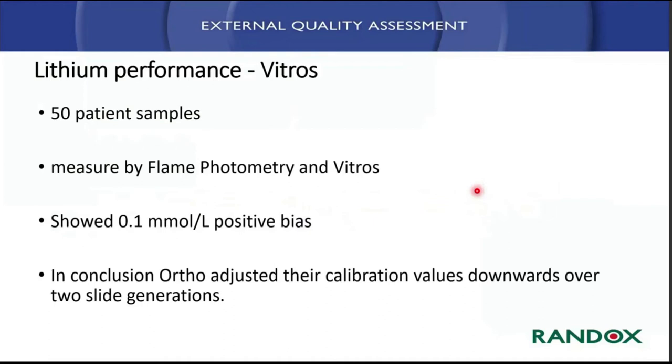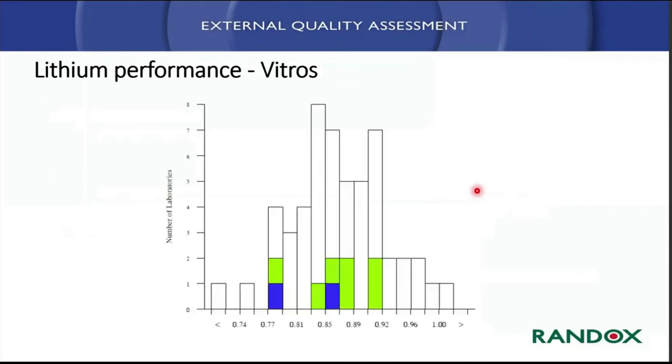We worked with various manufacturers, and in this case we worked with Ortho, and they adjusted their calibration values downwards over two slide generations. And once they had done that, you can see how the Vitros system then merged in with the other wet chemistries.